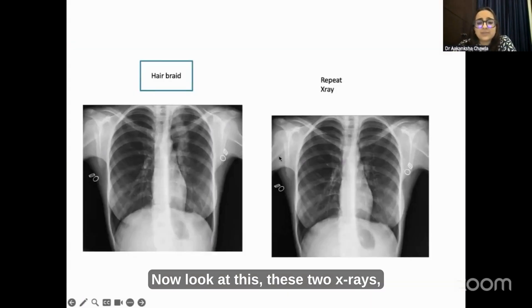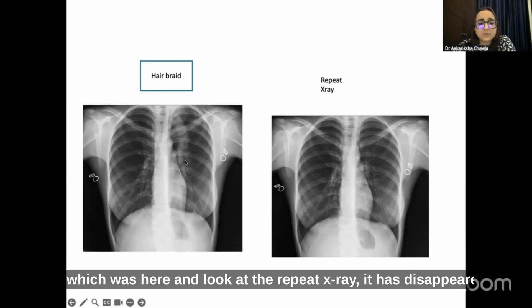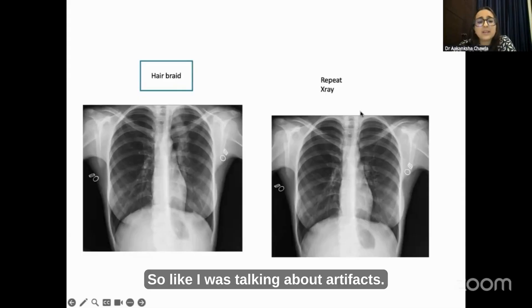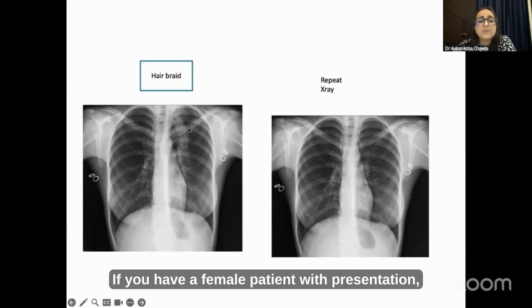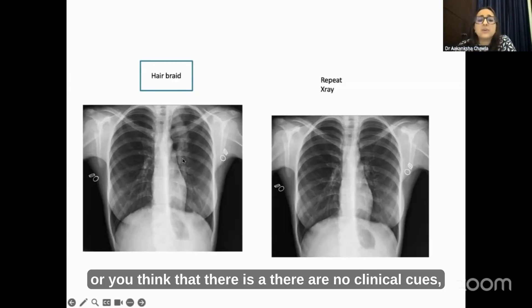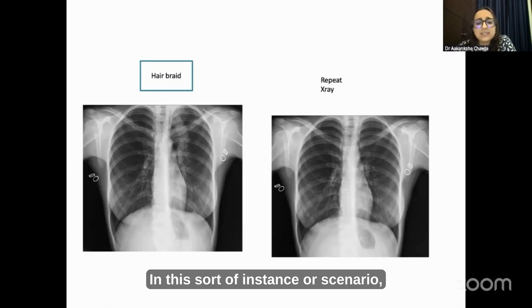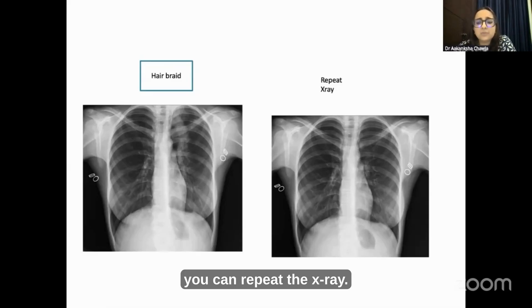Look at these two X-rays — a hair braid was present here, and in the repeat X-ray it has disappeared. This is an artifact. If you have a female patient whose presentation does not suggest any pathology and there are no clinical cues, in this sort of scenario you can repeat the X-ray.